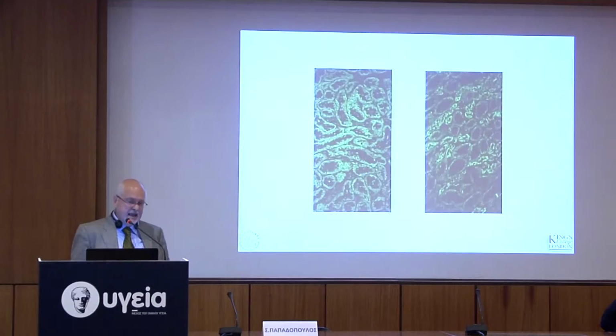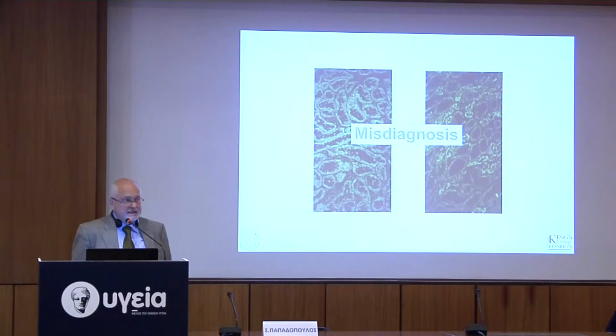Why do you make the mistake? Because if you use only the kidney disc, on the left you have one antibody, on the right you have the other one. So the misdiagnosis is frequent enough.